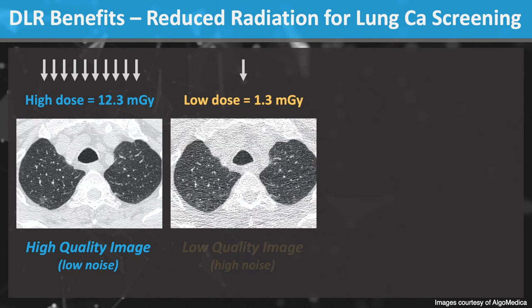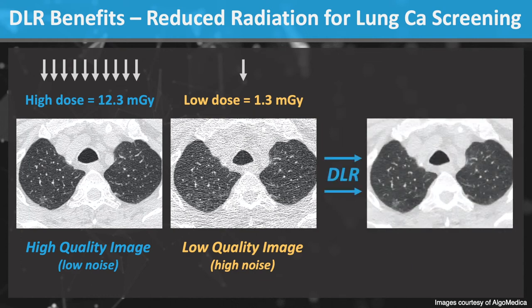In this separate image acquisition, the radiation dose was reduced by nearly 90%. These images have low quality due to high image noise. DLR can be used to reduce the noise and obtain high quality images from this low radiation dose scan.